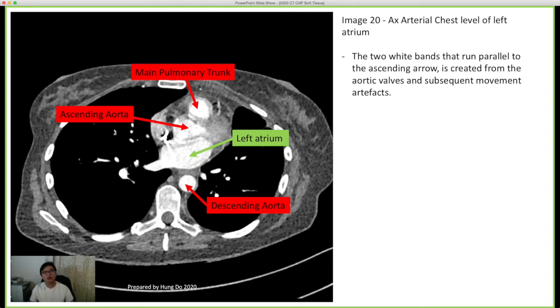A couple of ways that you can go about trying to improve the image quality, or reduce the cardiac motion, is to give beta blockers to slow down the heart a little bit, or to scan faster, or a combination of that and do a cardiac ECG trace to image the patient's heart in a particular phase where the heart is at rest for the best chance of not having motion artifact.